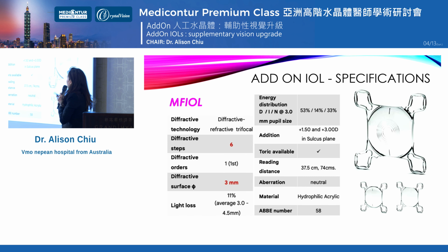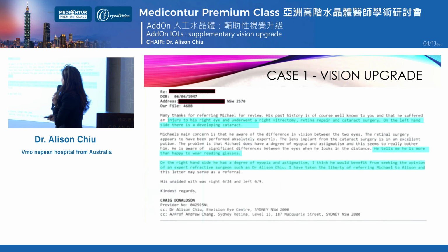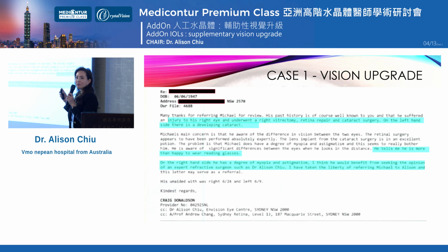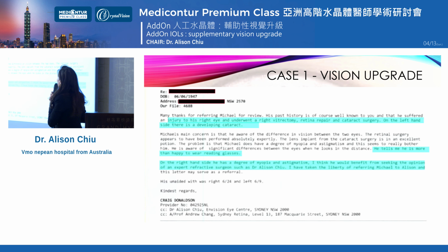So these are the specs. I just really wanted to highlight the 6 diffractive rings, which I had already spoken about. This is not great resolution, but I'm going to read this out because this is my first case.